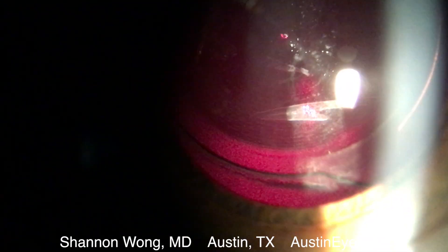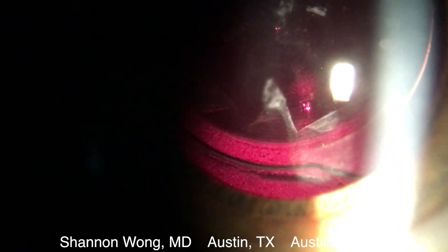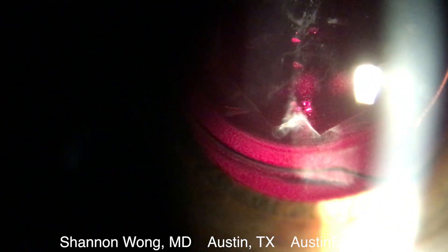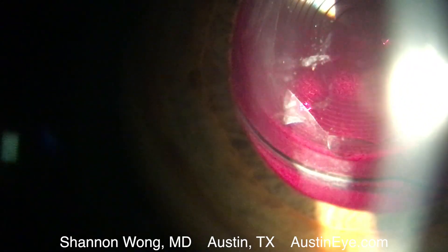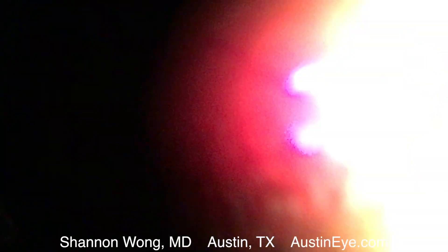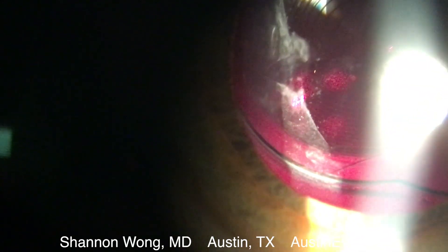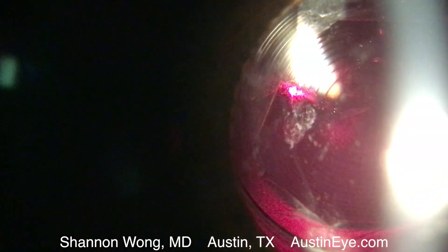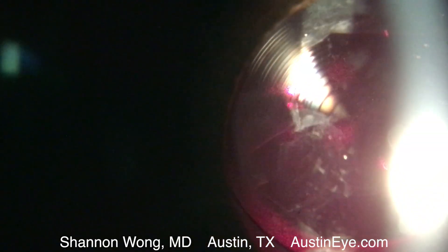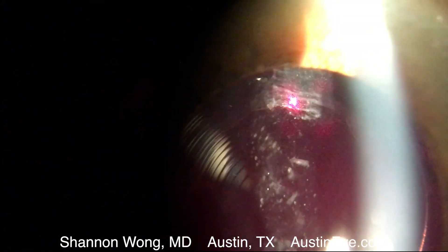You can see small fragments of the capsule suspended behind the implant — these might be seen at a later time as small floaters. These floaters usually dissipate over a period of days to months. The patient feels nothing during the treatment, just mild vibrations — no pain whatsoever.